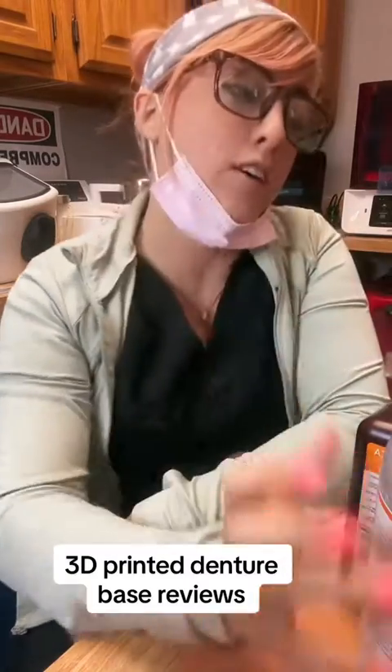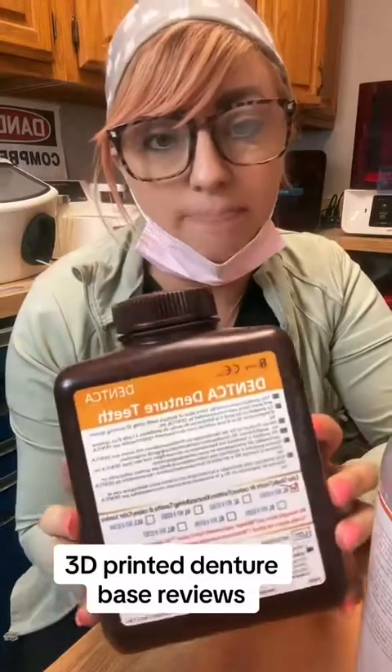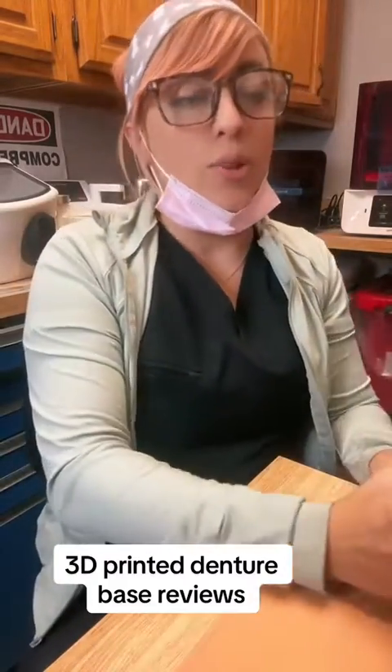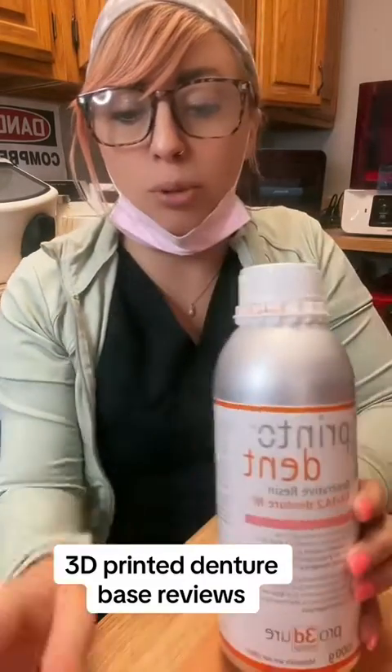Here's the original denture base — not a huge fan of it. Pretty brittle, pretty translucent. I don't mind the translucency at all, but it is brittle. We're just using what we have left for immediate dentures when we know we're for sure going to replace it. Not my favorite to use.